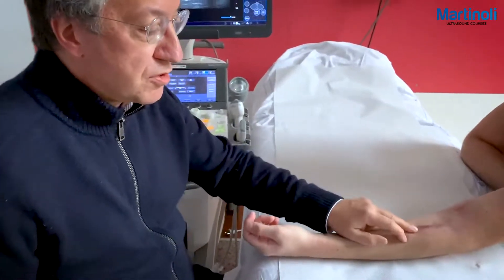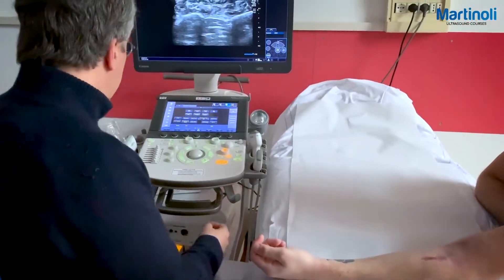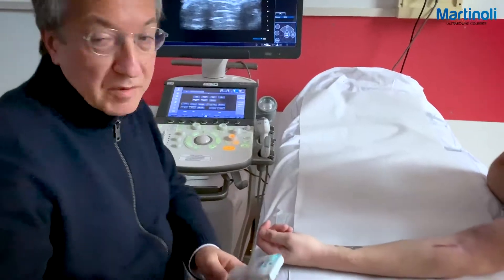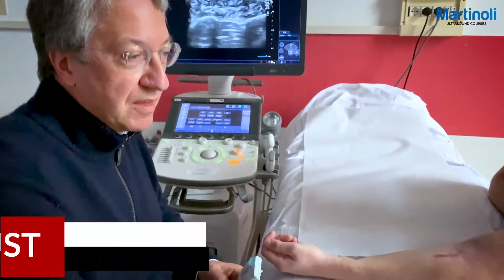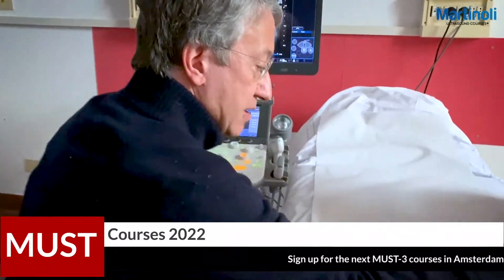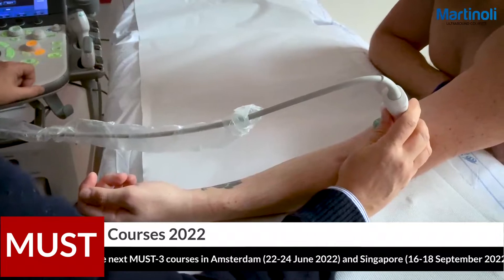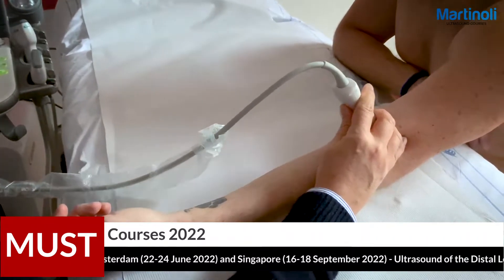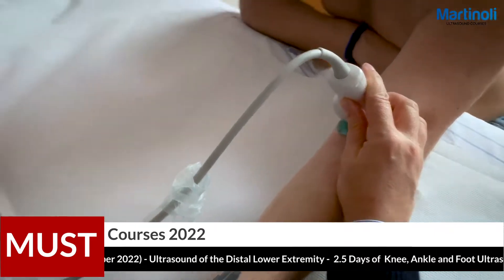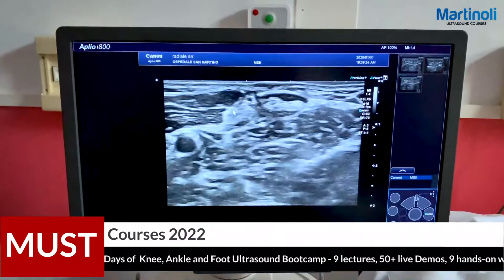We see two surgical scars here related to the previous surgery. Now we place the probe — give me some gel please — over the distal biceps. This is the image: this is lateral, this is medial, this is the long head, this is the short head of the biceps.